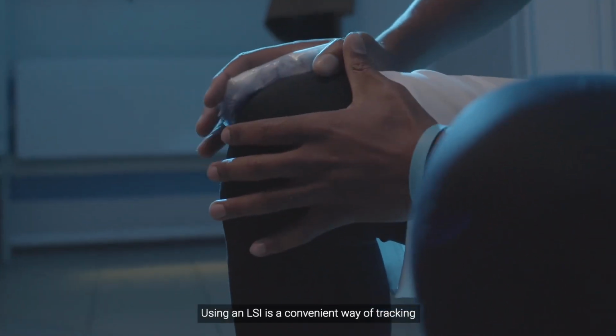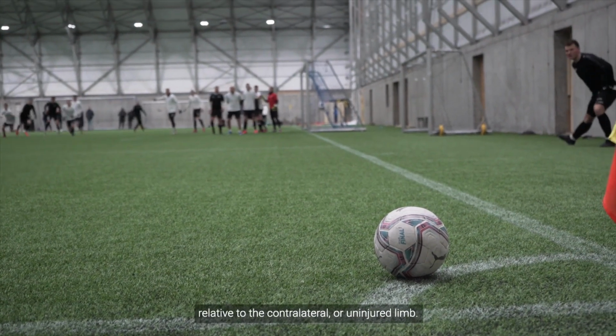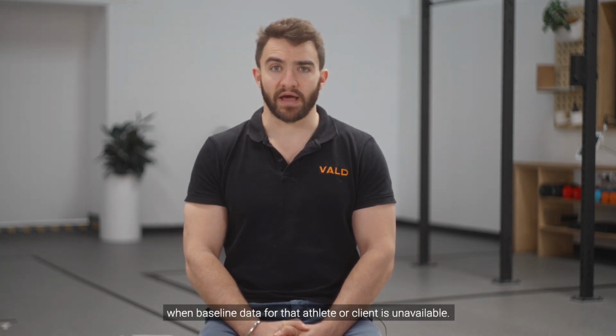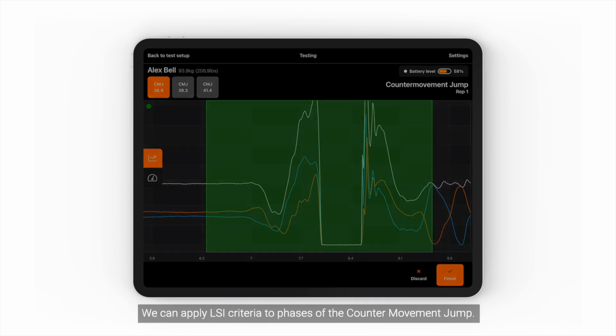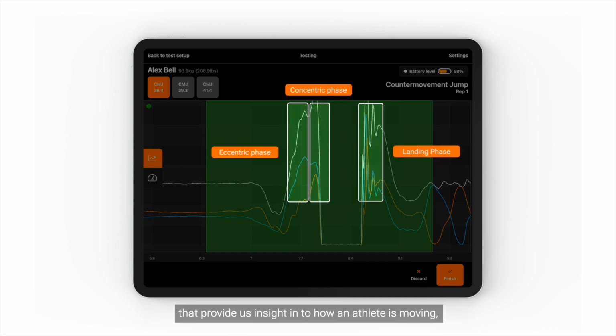Using an LSI is a convenient way of tracking how well an injured limb is performing relative to the contralateral or uninjured limb. This is especially helpful when baseline data for that athlete or client is unavailable. We can apply LSI criteria to phases of the counter-movement jump. There are 3 specific phases of the counter-movement jump that provide us insight into how an athlete is moving.